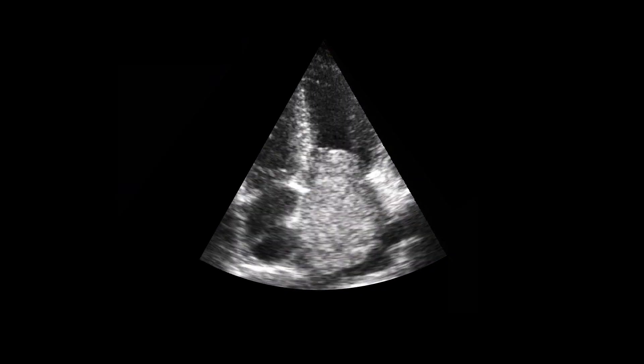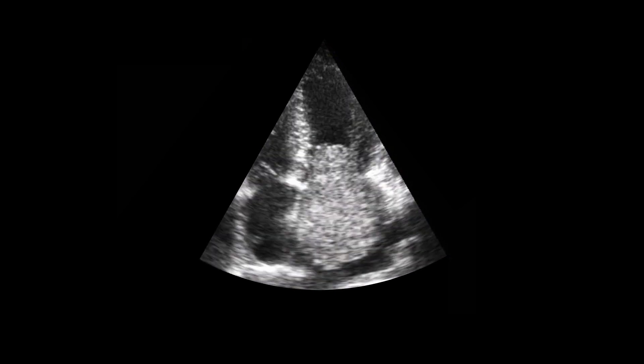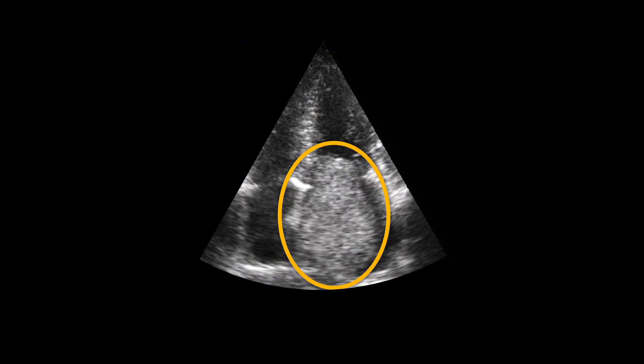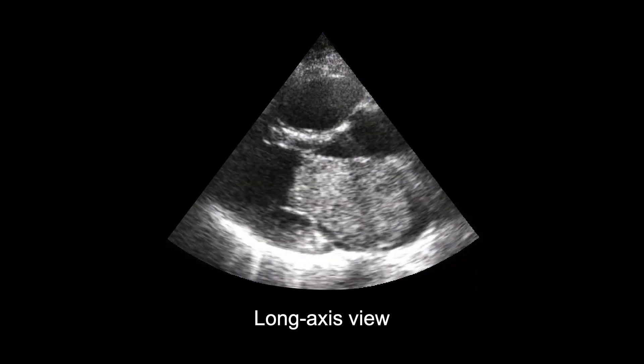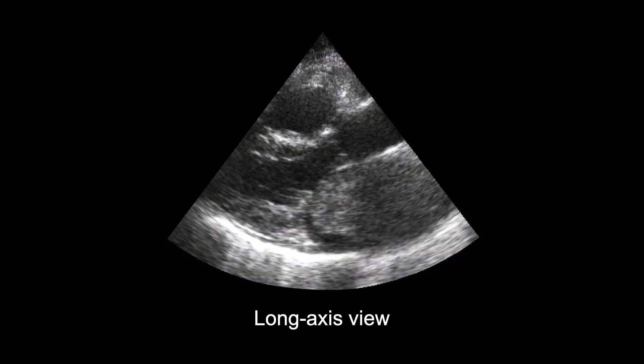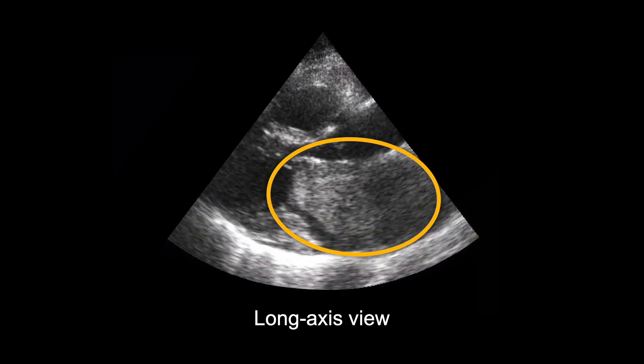Abnormal masses can also develop in the left atrium. 2D echo only provides limited views of left atrial masses. Here we see the full chamber view. Here we see the long axis view. It often does not allow a clear visualization of the insertion point of the mass.